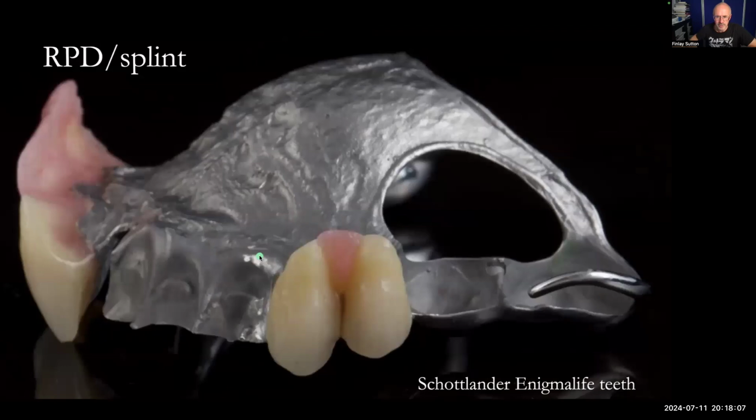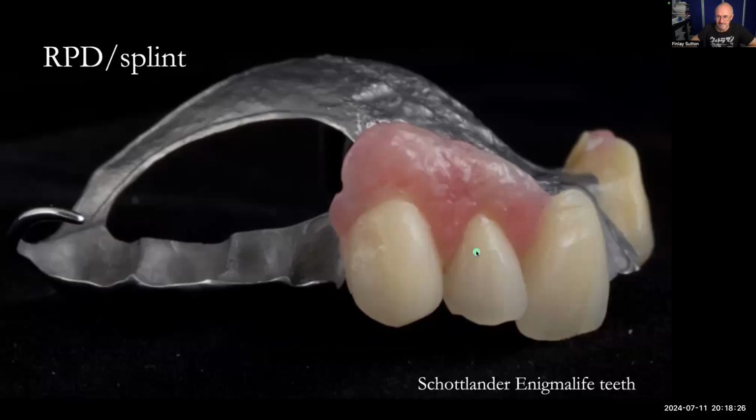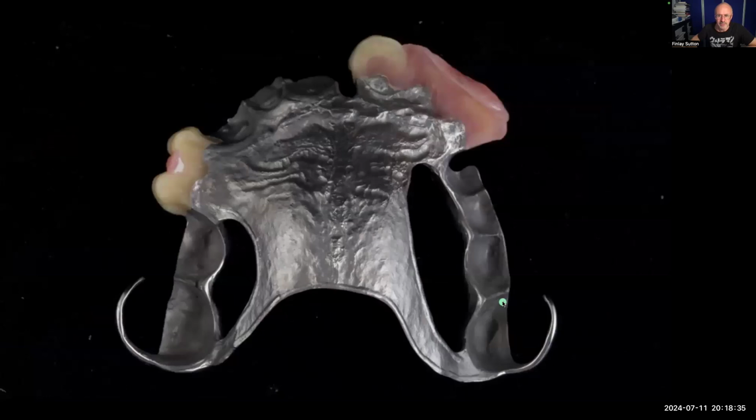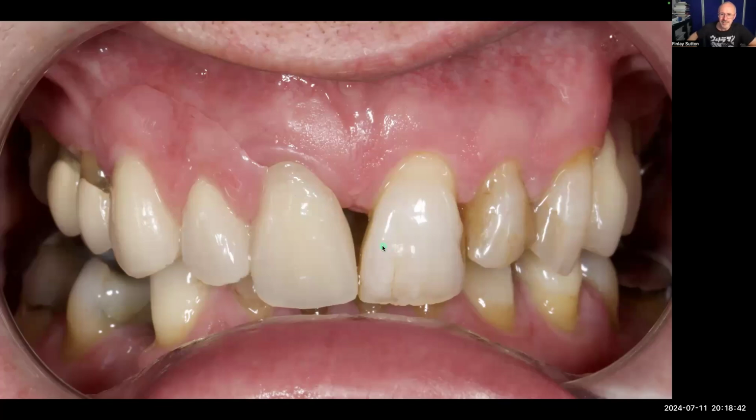It's lovely, like that. I've not done any prep, interestingly, on these, where this is just tooth wear. He's got these ledges on these upper teeth, and that acts like rest seats. They're almost like pre-made rest seats for me, which is great. Look how Rowan's been brave with the tooth position just there on that lateral incisor too. So that's the end denture ready to be fitted now. And that's it fitted. And you can see here how nice the gum work is where we've got it sitting against the root surface of that tooth there. And this nice, very thin flange just replacing that missing tissue.